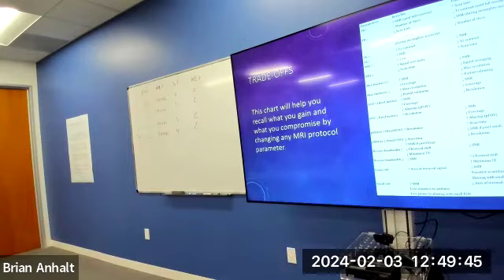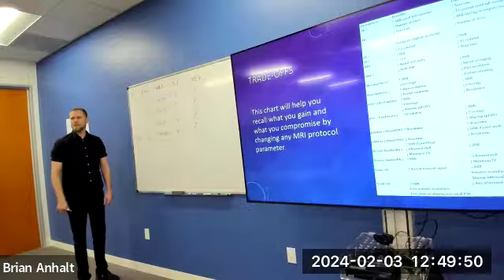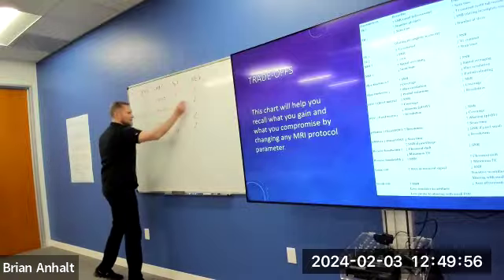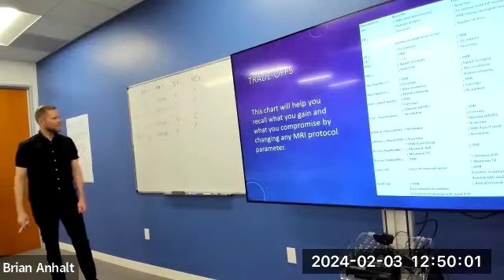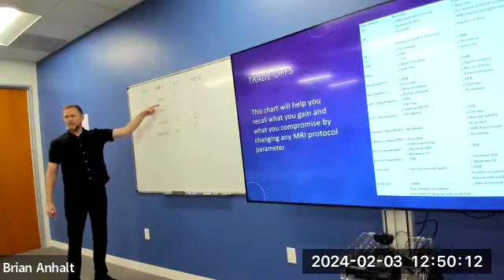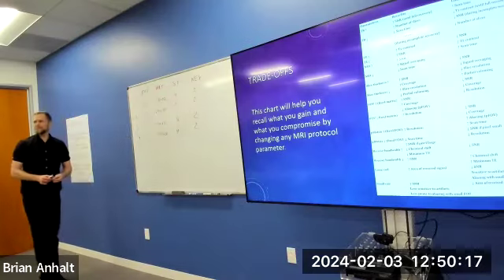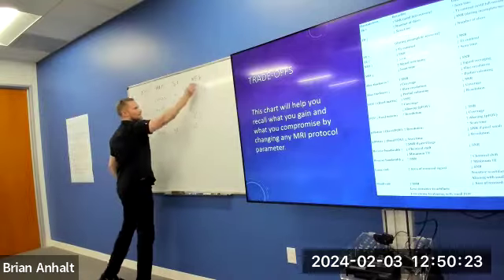Biggest, right? Here's my trick, field of view has the biggest impact on it. Go to your field of view. Which one has the largest field of view? 1 and 4, right? I don't even look at this anymore. These are gone. Look at the slice thickness. Both are the same. That doesn't tell me anything, does it? Look at the matrix. Which one has the coarser matrix? 1, right? Largest field of view, coarsest matrix, slice thickness doesn't say anything, either does NEX, right? Number 1 it is. This has the best SNR out of all of these.